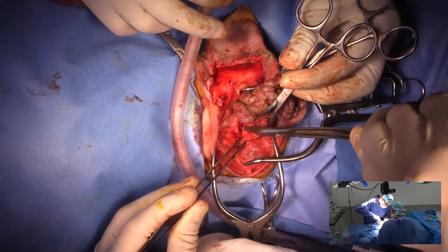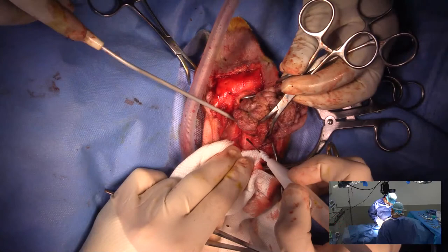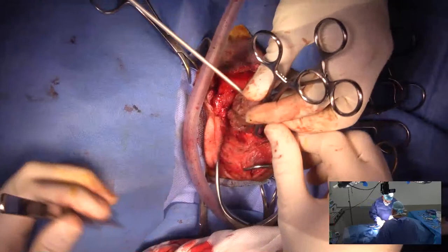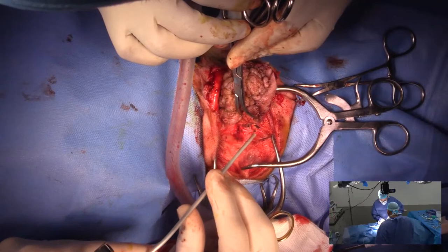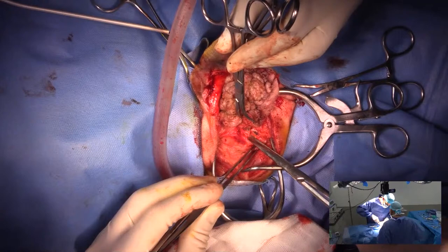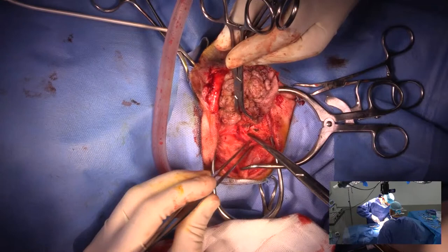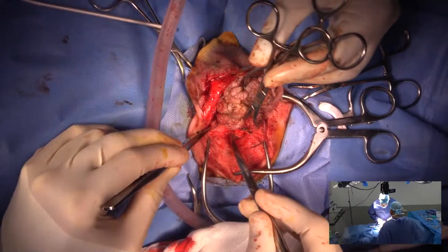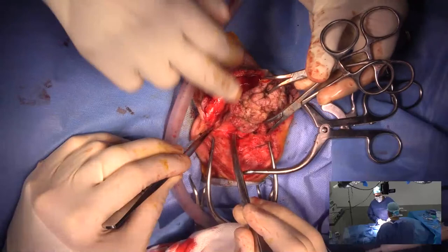And staying right on that auricular cartilage again is the key in trying to avoid that facial nerve. And the facial nerve could be right in the middle of this stuff right here, and you wouldn't know it. There's some discharge coming out right here. So I've gone into the lumen of the ear canal, which is not a big deal. Nice to stay out of it if you can. I think that may be a branch of the facial nerve right there. I don't know if you guys can see that, but there's just a little white thing right there.